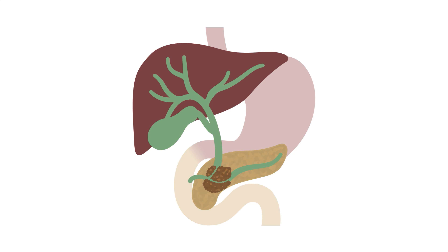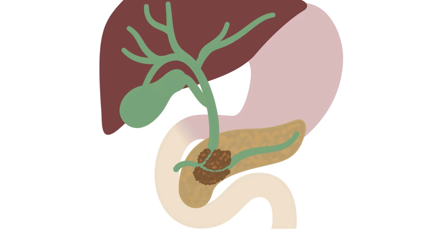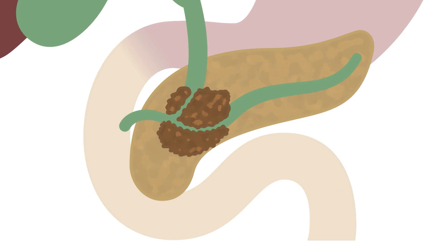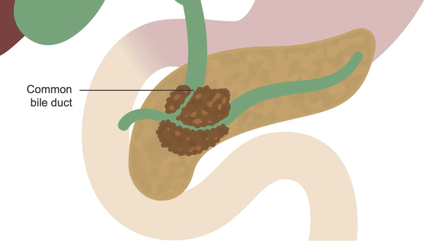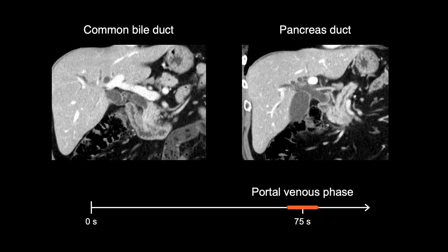In many cases of pancreas adenocarcinoma, the primary tumor can be difficult to see. The best way of determining its boundaries is to look for the point where the common bile duct or pancreas duct change size due to obstruction caused by the tumor. In this patient, both the common bile duct and the pancreas duct are obstructed by a pancreas head adenocarcinoma, referred to as the double duct sign.